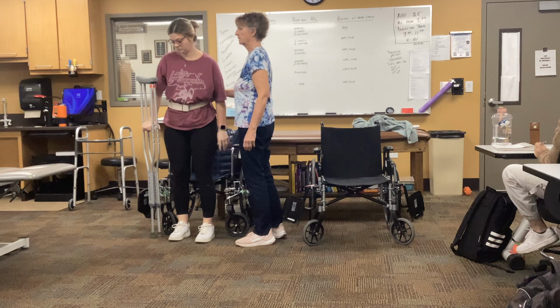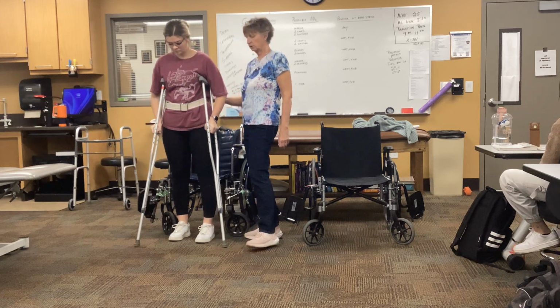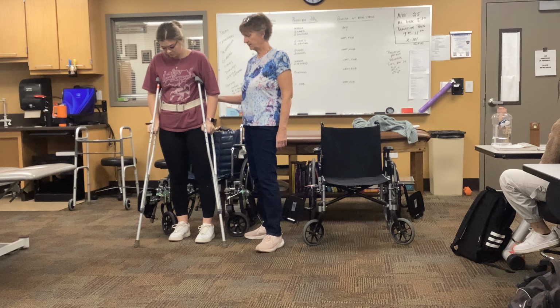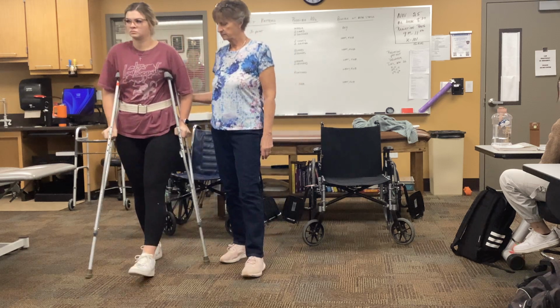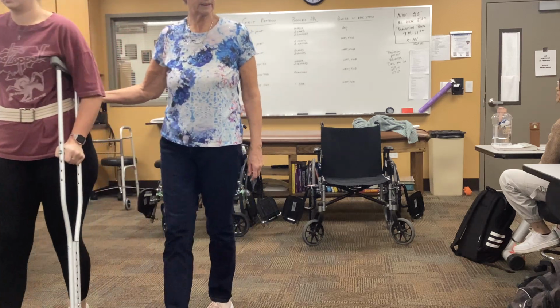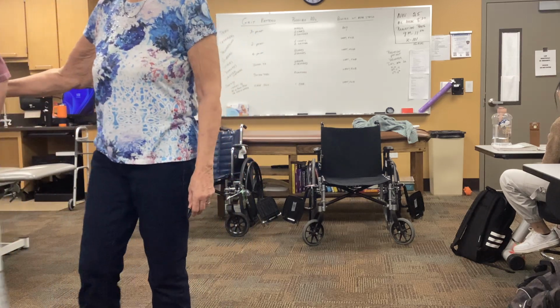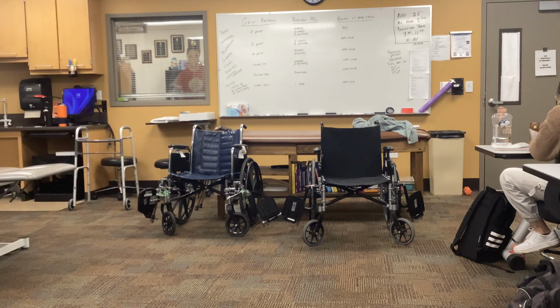Alright, show me a 2-point gait with crutches. Okay, looks the same, yes? Just turn around. Alright, 4-point gait with the crutches.